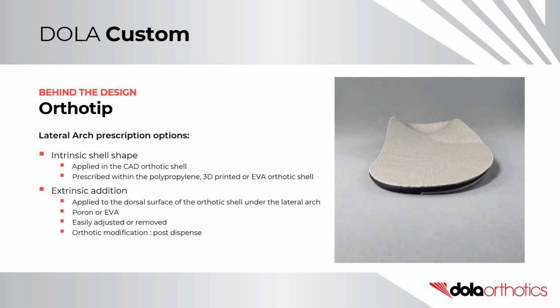Orthotip. Lateral arch prescription options. It can be prescribed as an intrinsic shell shape applied in the CAD design process and prescribed within a polypropylene, 3D printed, or EVA orthotic shell.